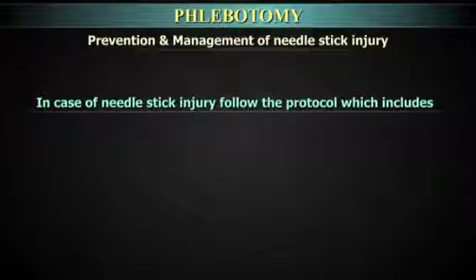In case of needle stick injury, follow the protocol laid down by the laboratory, which is written and displayed in the collection area.